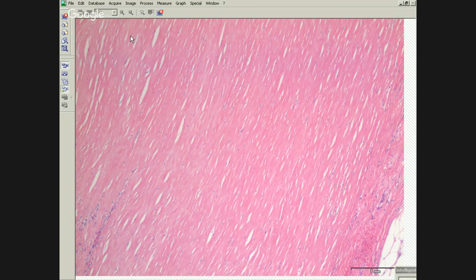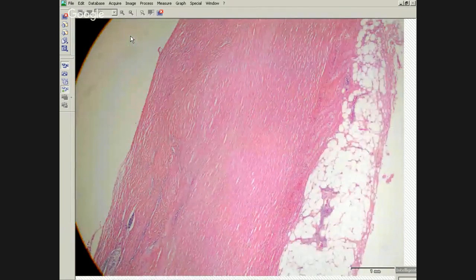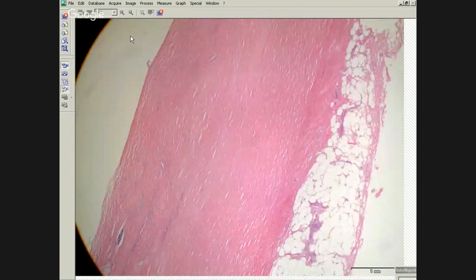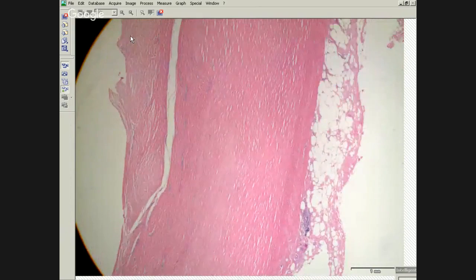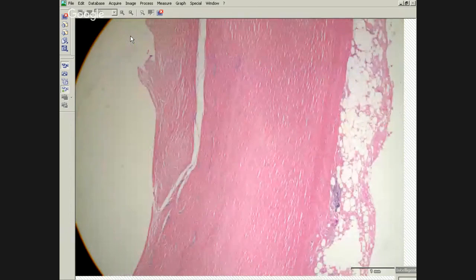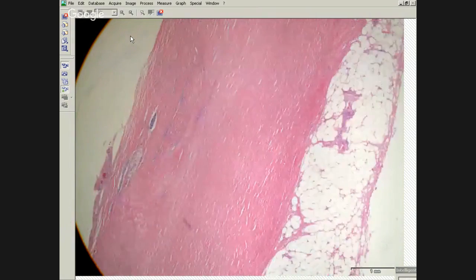And that's a very important feature of benign fibrosis of the pleura. This is an example of a pleural plaque. So it's very hyalinized and has this basket weave pattern. But anytime you have pleural fibrosis, the fibrosis gets laid down and entraps mesothelial cells, it'll maintain a linear orientation, which you can appreciate with a well-oriented specimen like this. So we have pleural plaque.